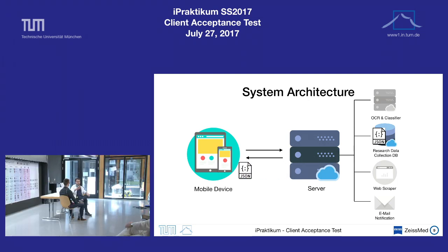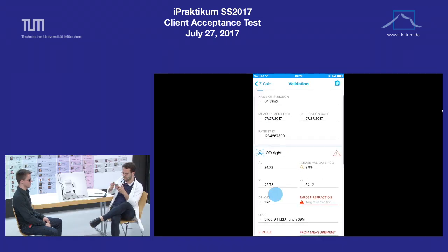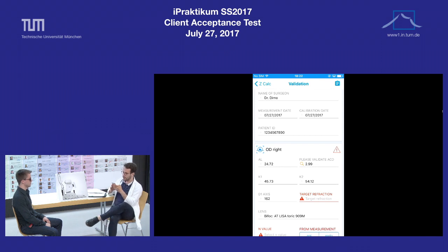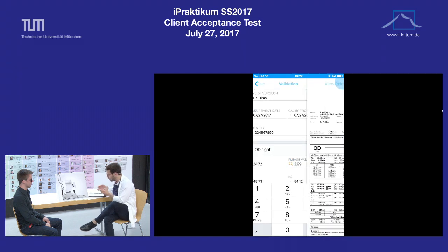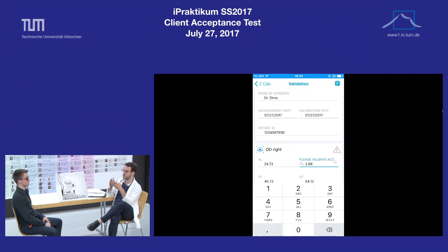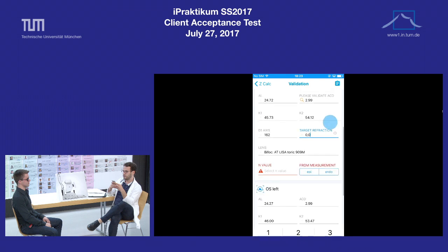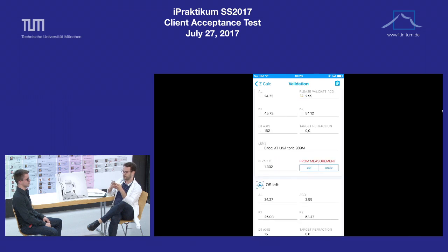Oh, this is so comfortable. I can do this just by sitting here. So the results are back in, and oh, you already got some results? That was really quick. So let me just check them. What I got here now is a value I need to double check, and I can do that also from the app because it just lets me view the image I already took, pre-processed. And this value is actually correct. And there are also some other values that I need to type in manually.